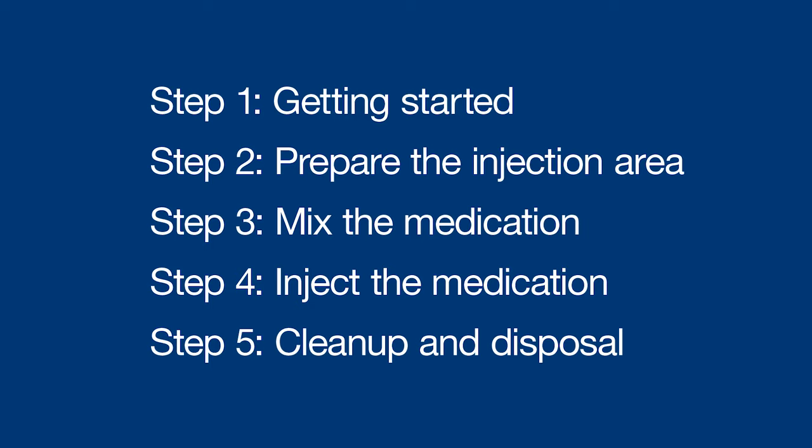Hey there, I'm Sophia and I'm going to walk you through how to inject Menopur under the skin or subcutaneously. These instructions are broken up into five quick steps.